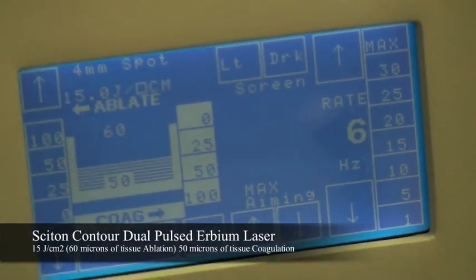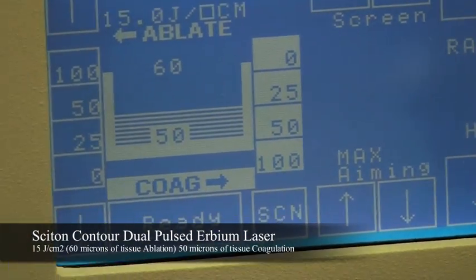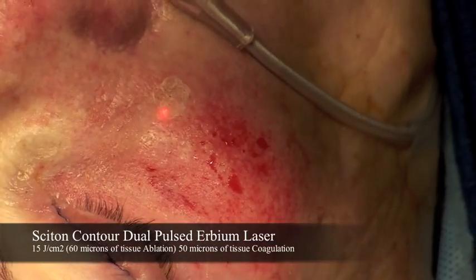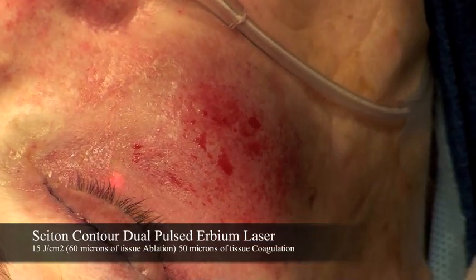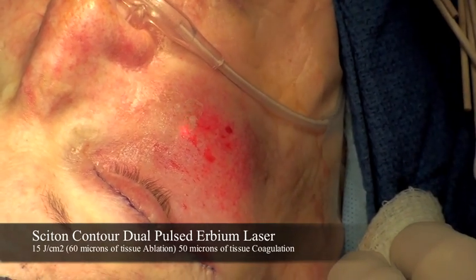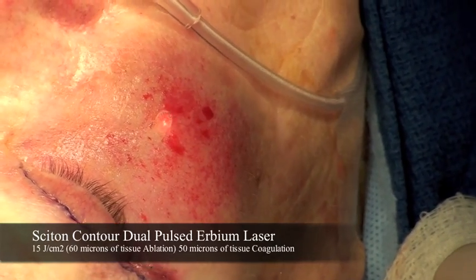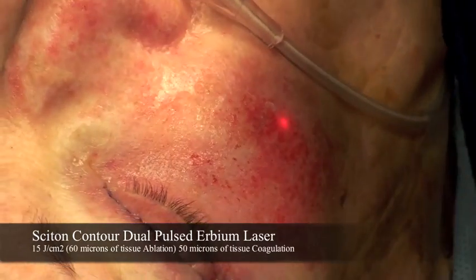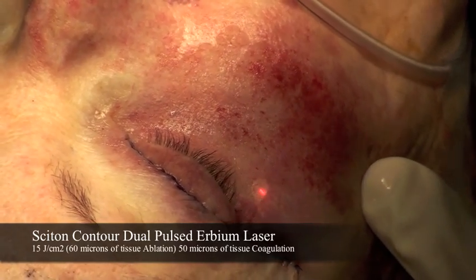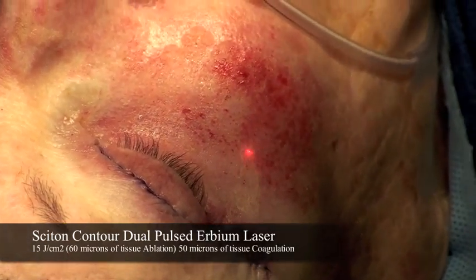With this second application of the laser, we keep the ablative fluence at 15 joules per centimeter squared, but with this laser we can then turn on a second laser pulse that fires just a few milliseconds after the first pulse, below the threshold for ablation. This subablative pulse has an interaction with the chromophore of water in the tissue, which creates thermal injury. This causes collagen fiber shrinkage and tissue desiccation.